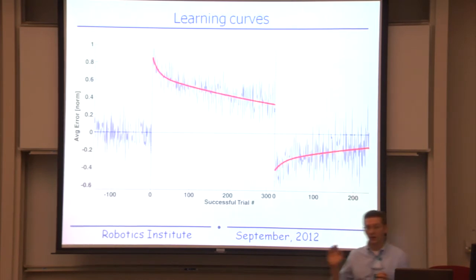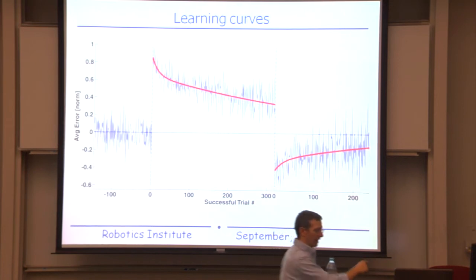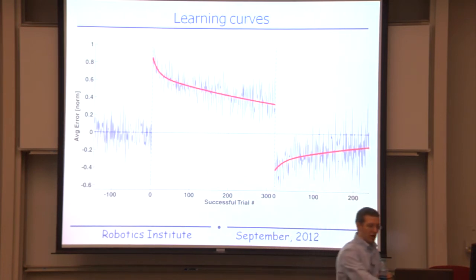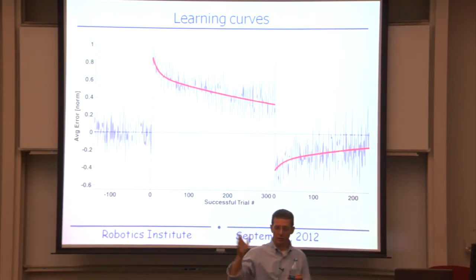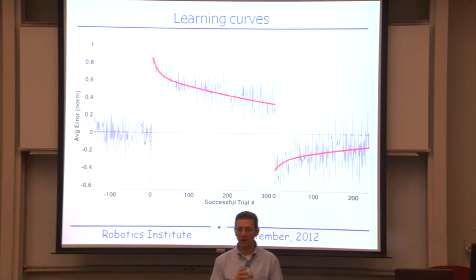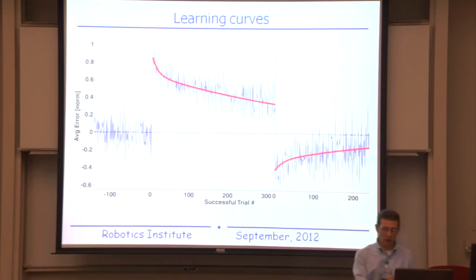And if we look at the learning curve in this system, if we just take the expected angular error, which is that average error there, and we plot that as a function of time, we see that those angular errors reduce as a function of time, where after about 300 trials, now the error is down to about 30% of what it is on trial number one. So he adapts to these visuomotor rotations quite well.